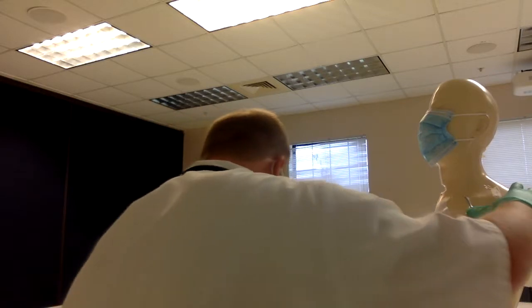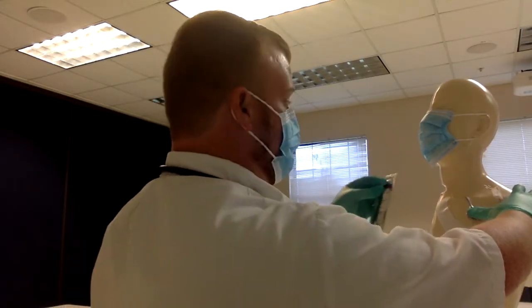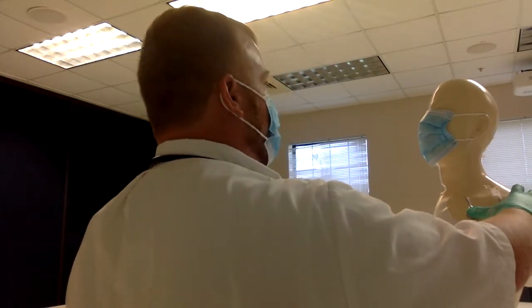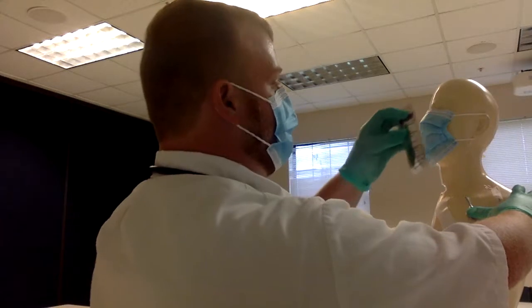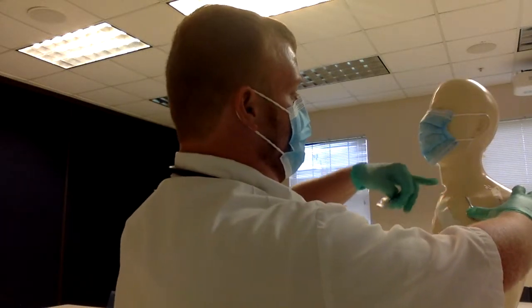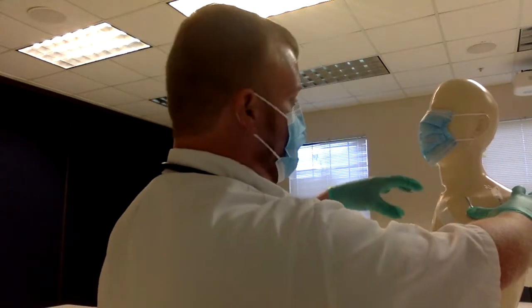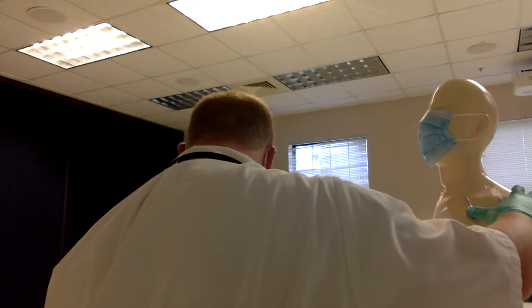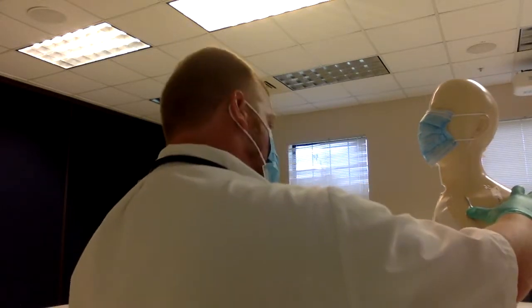Let's see, there are these alcohol swabs. With the alcohol, you can clean around the area and let it air dry. Never try to fan anything, because you can blow particles and bacteria in there. So we're not going to mess with that, and we're going to let it dry.